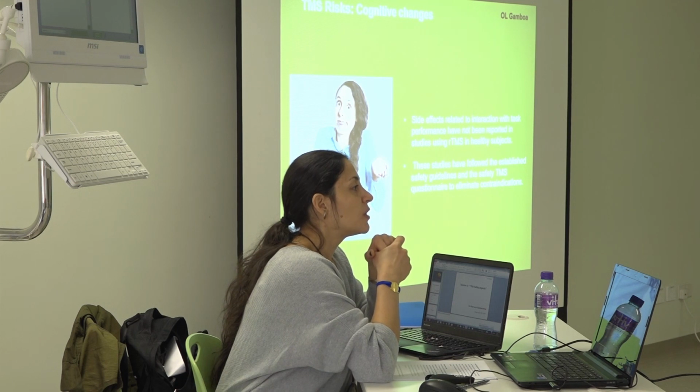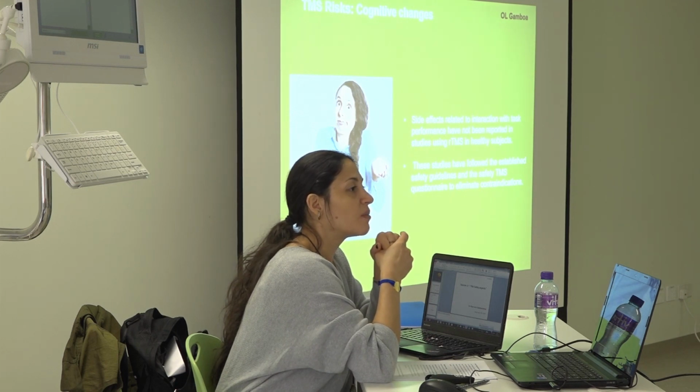Cognitive changes. There have not been cognitive changes reported. Imagine how horrible it would be. If there were cognitive changes due to our TMS, we wouldn't be doing it, right?